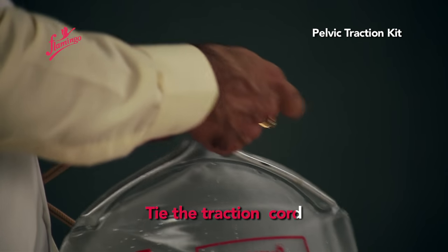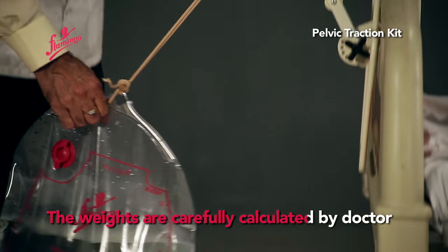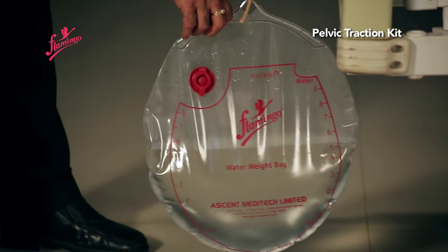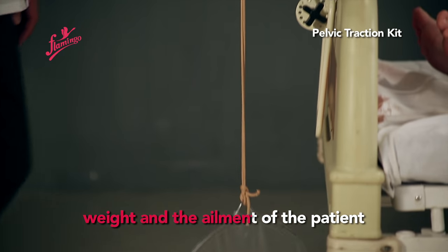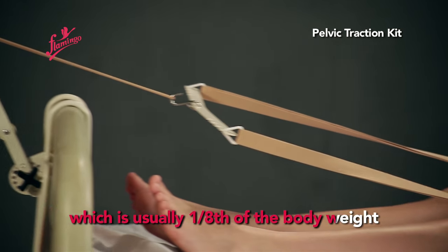Tie the traction cord to the water weight bag. The weights are carefully calculated by the doctor considering the age, weight, and ailment of the patient, which is usually one-eighth of the body weight.